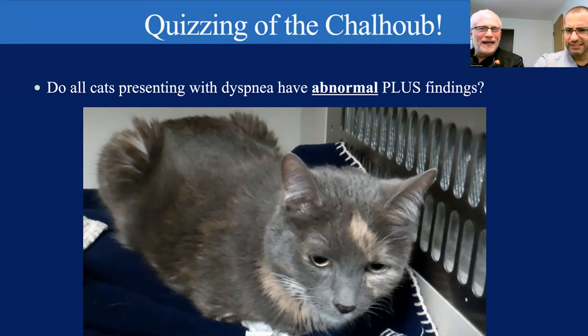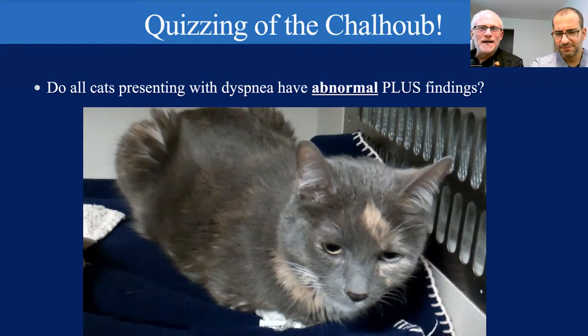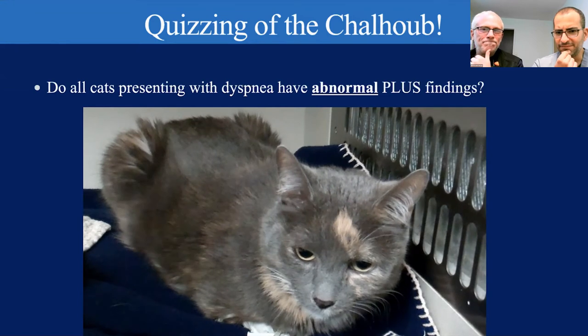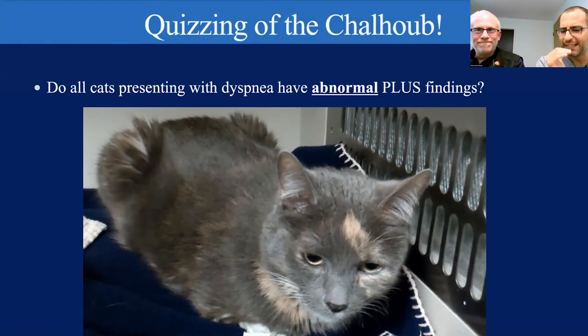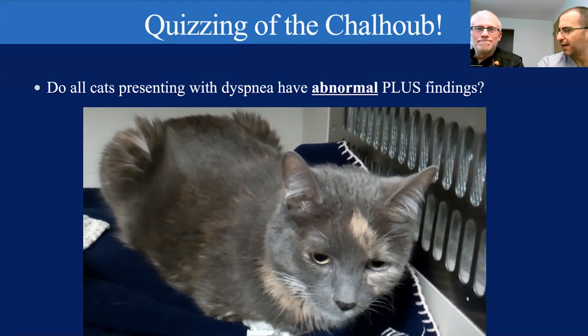Dr. Chalhoub, my question for you: do all cats presenting with dyspnea have abnormal pleura and lung ultrasound findings? I'm going to say no, Dr. Boysen, because I feel I have seen some cats that come in for dyspnea and they have normal PLUS findings.